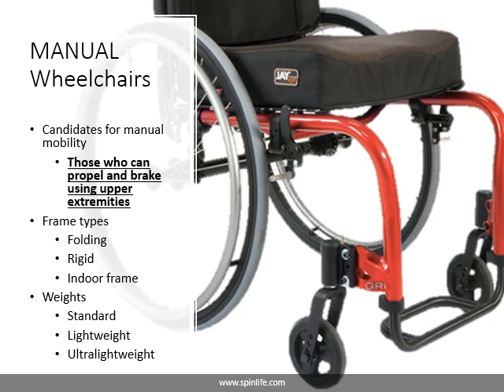adjustments that can be made to wheelchairs. Manual wheelchairs will be recommended for people who can propel themselves, and they can use brakes using their upper extremities. There's many different types of manual wheelchairs. There's folding frames, there's rigid frames, there's ones that are made specifically for people who've had a stroke, so they're called hemi frames, and you can get wheelchairs that are very, very lightweight or ultra lightweight, or just standard, made out of standard metal. And so all of these things are things that would be considered by the evaluation team.